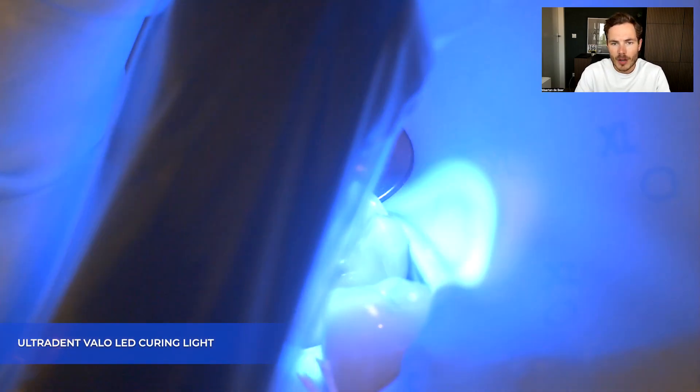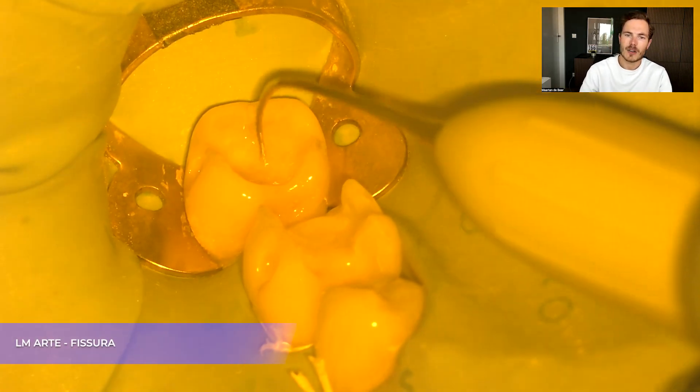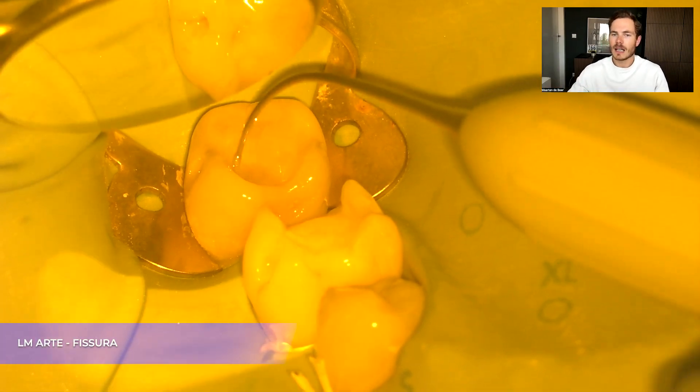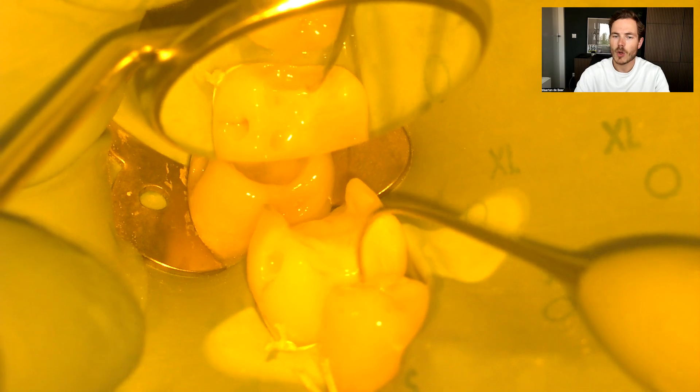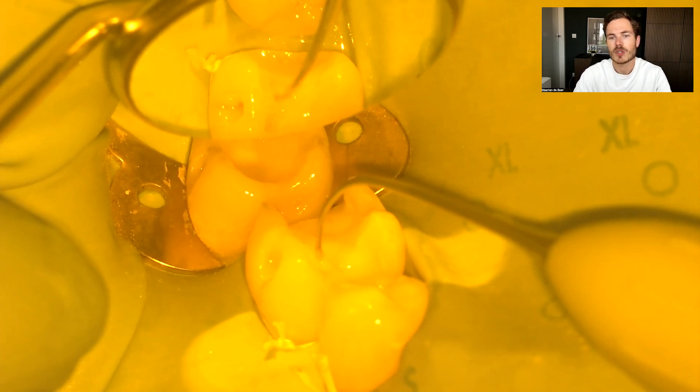If in this case there had been some old composite remnants left, I also would have used a silane. I then light cure my bonding, and the first thing I do is start with a flowable. I use the Majesty ES Super Low Flow by Kerr to create my immediate dentin sealing, or bio base, which is the first layer. This optimizes the geometry of the prep and ensures all the dentin is already sealed so curing can begin.